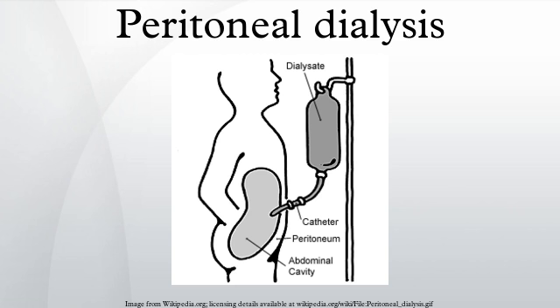Compared to hemodialysis, PD allows greater patient mobility, produces fewer swings in symptoms due to its continuous nature, and phosphate compounds are better removed, but large amounts of albumin are removed, which requires constant monitoring of nutritional status. The costs of PD are generally lower than that of HD in most parts of the world. This cost advantage is most apparent in developed economies. There is insufficient research to adequately compare the risks and benefits between CAPD and APD.